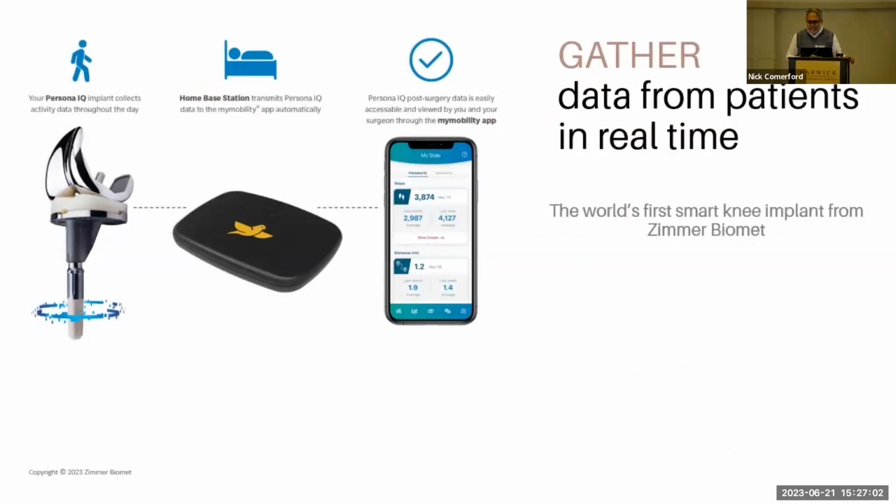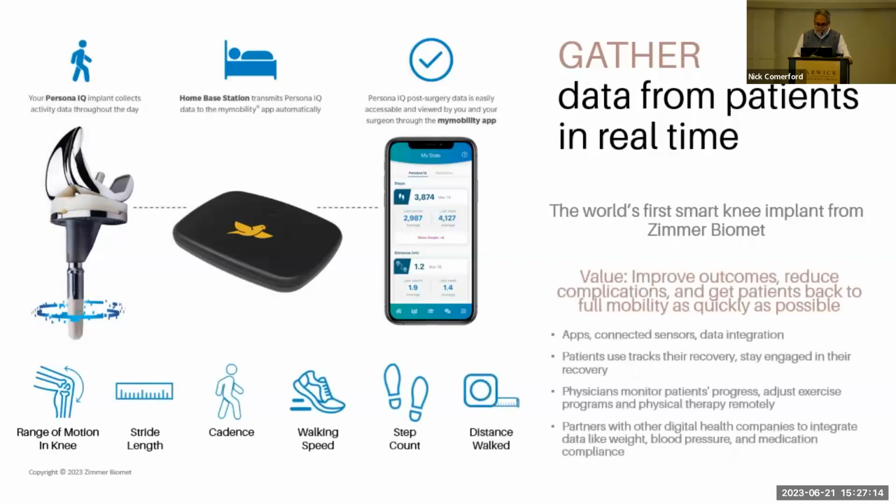So I'll give one nice example. When I ran across this example, it surprised me. I don't think we have anyone from Zimmer here, so I won't insult anyone from Zimmer. This is a unique application of taking a purely mechanical device, a knee implant, and making it a smart connected device.